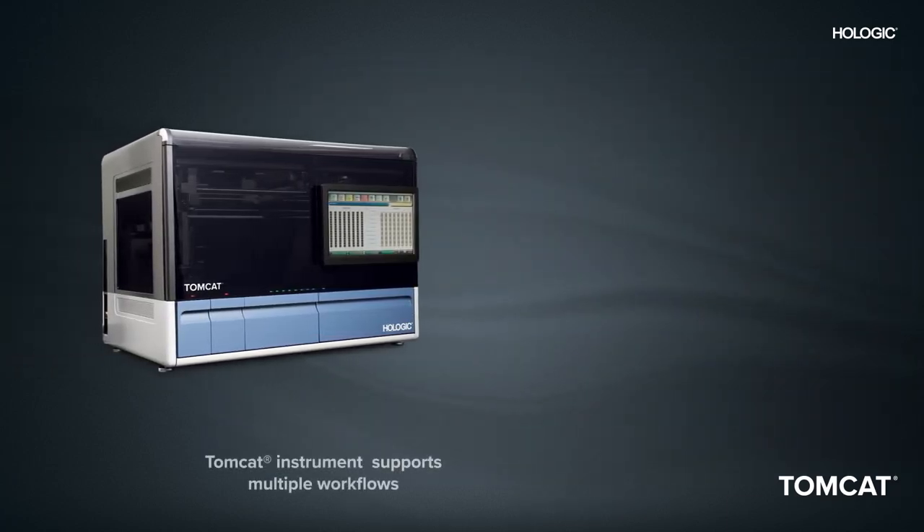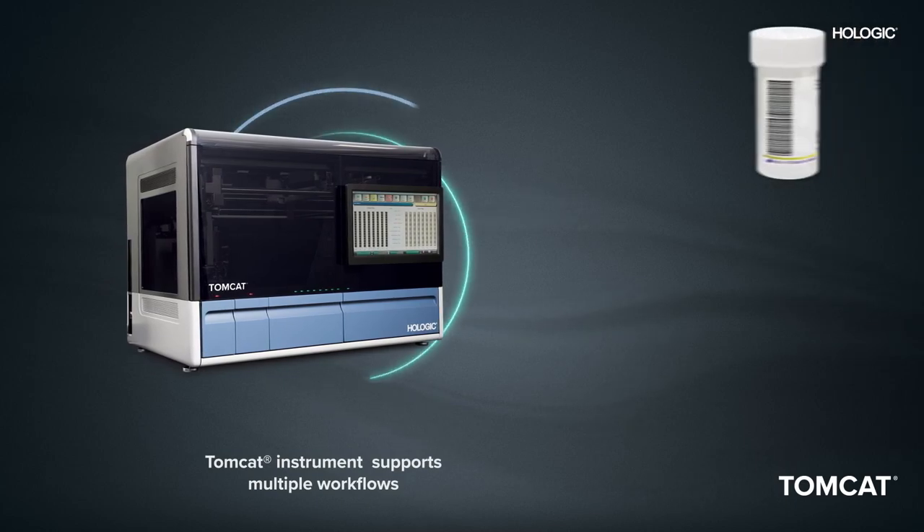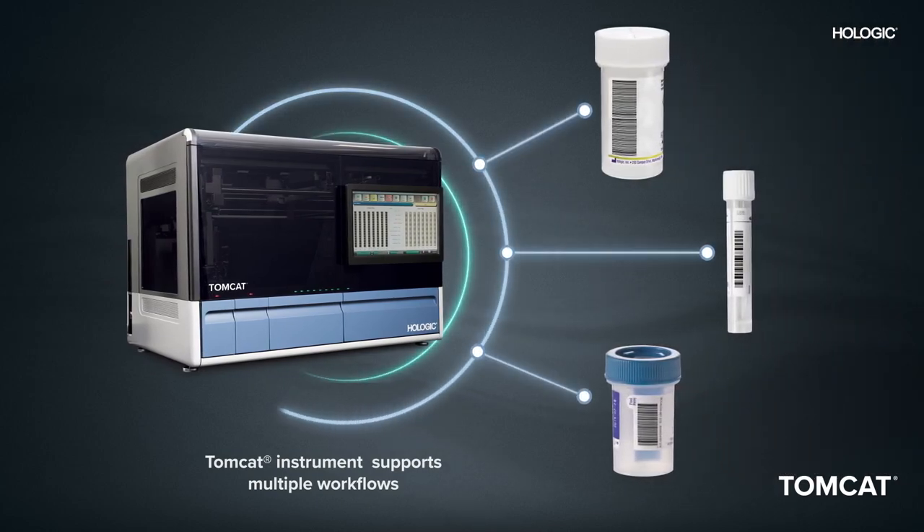Designed for flexibility, the Tomcat instrument supports multiple workflows including different primary tube sizes, mixing parameters, and options for reagent addition and incubation if needed.